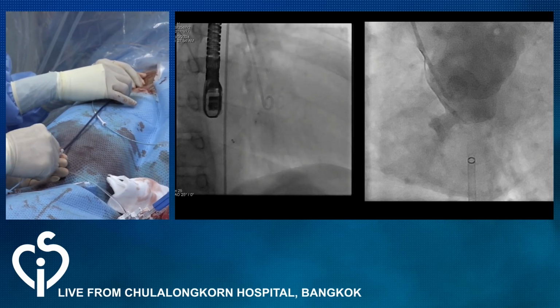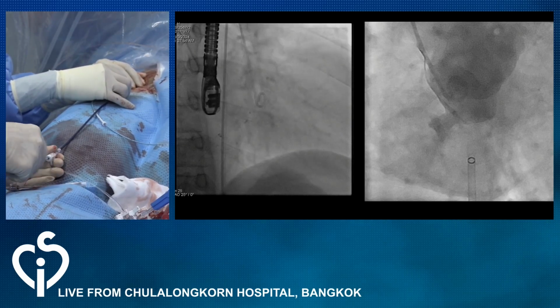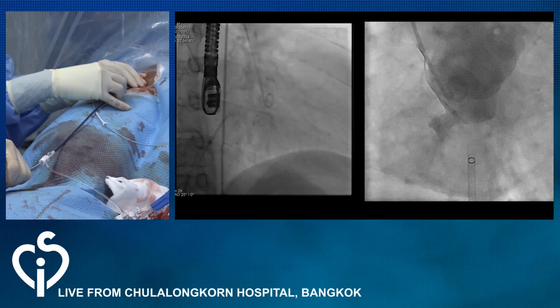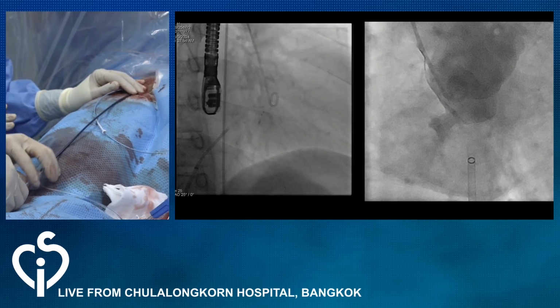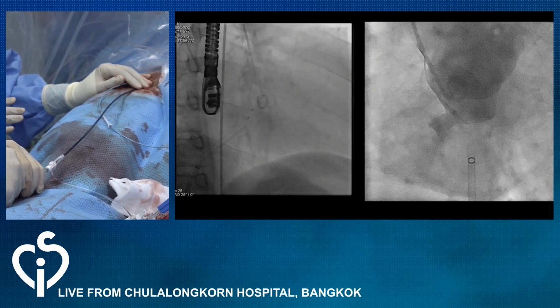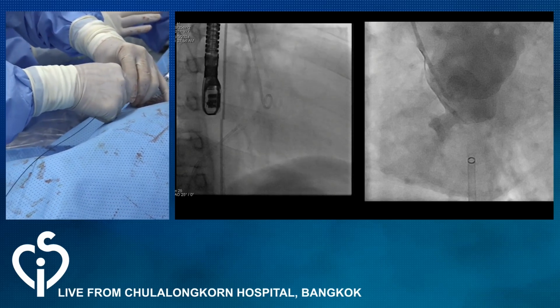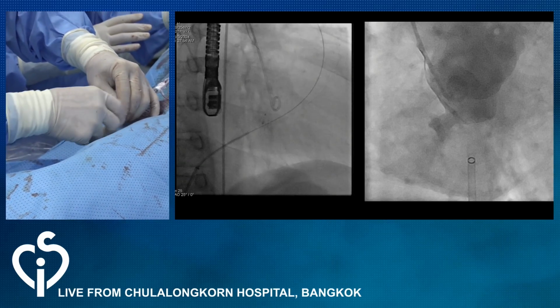Right. And it was just a minor point. The coronary arteries are a long way away on that aortogram, so that's one of the concerns. We can have the LV end-diastolic pressures too, just with the push of the pigtail catheter. Yes. Okay, right.